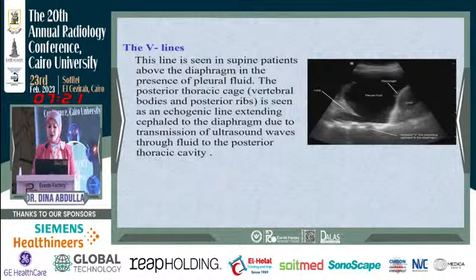The seashore sign is a dynamic sign of normal lung. We can see it in M mode, described as a complex picture of parallel lines like sea waves representing the static thoracic wall layers, and the granulous pattern like sand below the pleural line represents the normal pulmonary parenchyma. This seashore sign is lost in presence of pneumothorax, and we can see instead the barcode or stratosphere sign. We will see it later.